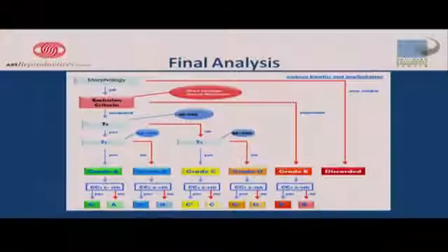If you look at the things that did the 1 to 3 or the 2 to 5 divisions, or the things that have the multinucleation, if you take those away, you've eliminated a lot of embryos that have almost no chance of working. You know, the 1 to 2%, maybe up to 15% maximum chance of working. If you take those out of your pool, what's left has a much higher percentage chance of success.